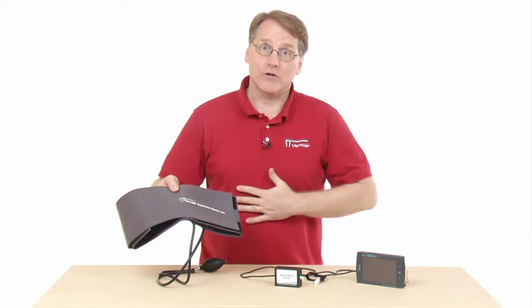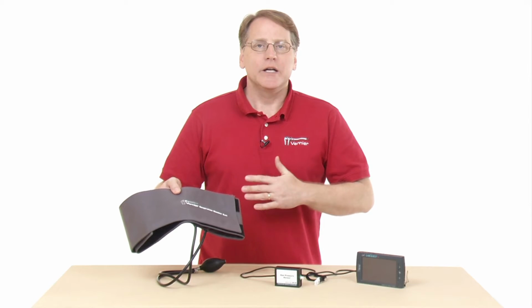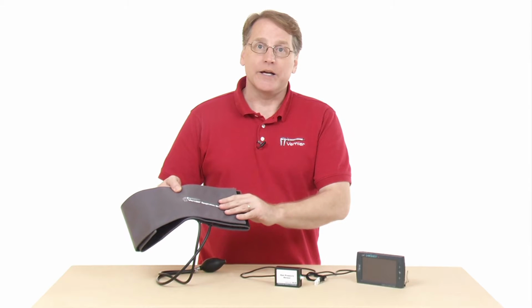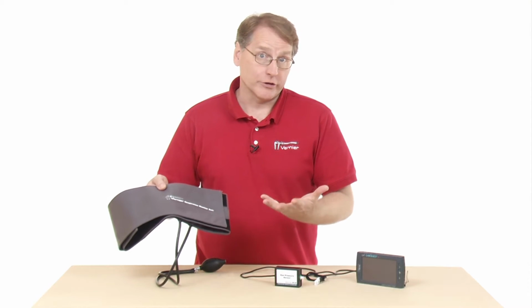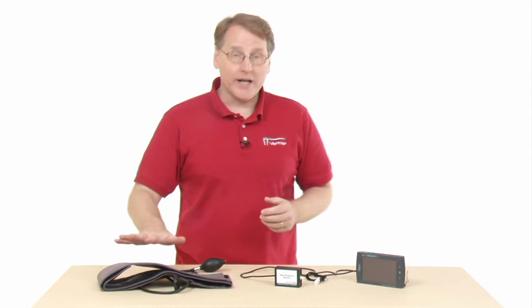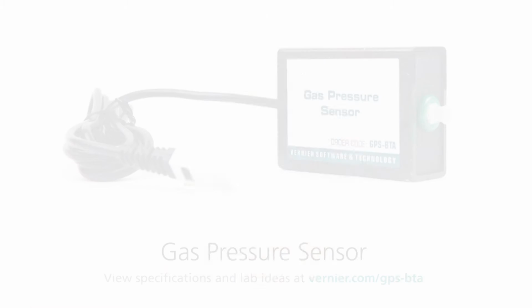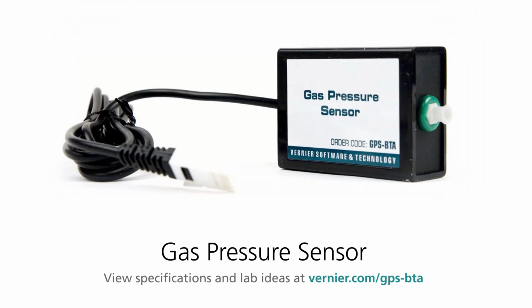So you're actually going to put it across here, and as you breathe in, it causes the pressure to fluctuate inside the cuff, and you measure that pressure fluctuation. Now, it's not a sensor unto itself. It actually has to be used with another sensor, and that's our gas pressure sensor. It's a commonly used sensor, so there's a good chance you may have some of these.